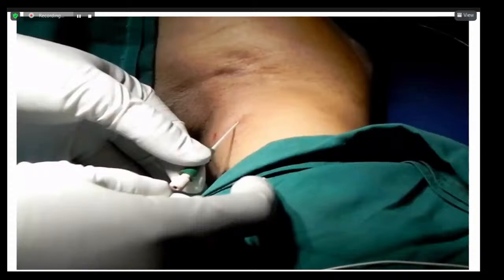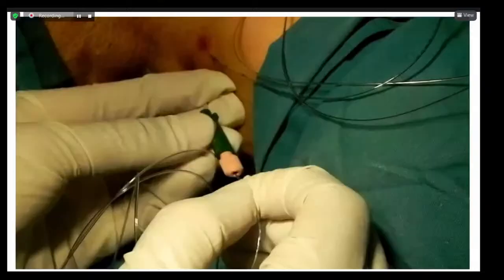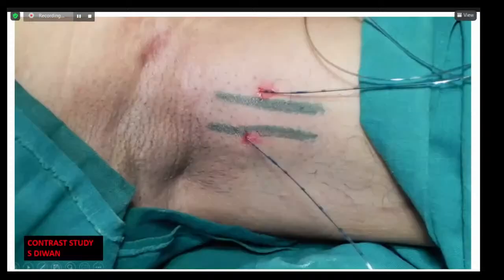This is what I also used to practice with the catheter going into the median nerve, but I used to use 2 catheters at that point of time because I know that the radial nerve is in a separate compartment. So I have a catheter in the median compartment and then a catheter in the radial nerve compartment. And then I used to inject local anesthetic in both the compartments. So you have got 2 catheters, which are maybe around 5 to 6 centimeters inside. And then we used to keep these catheters for almost 5 days.